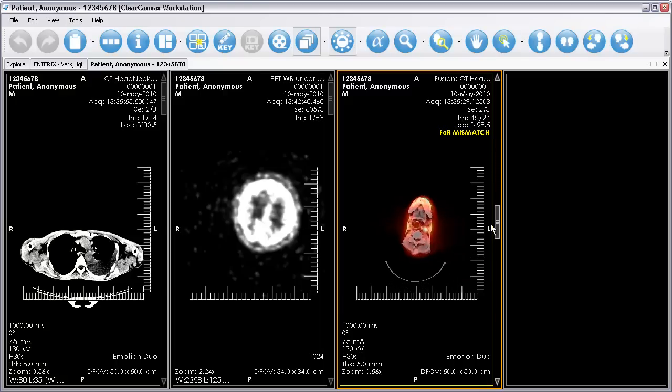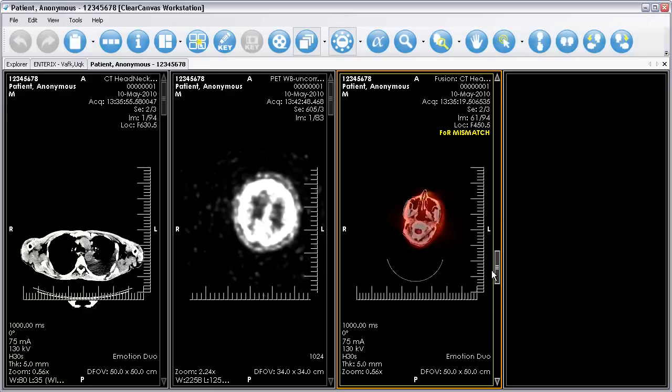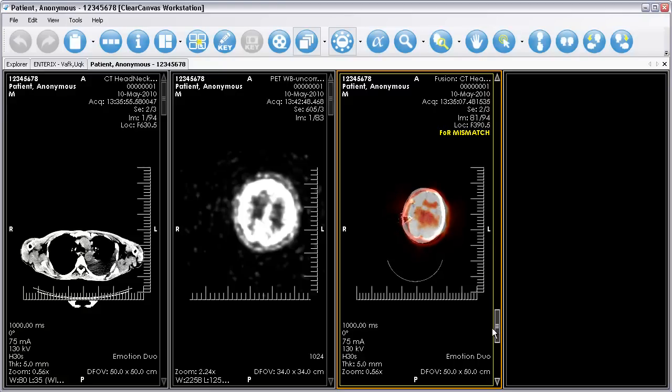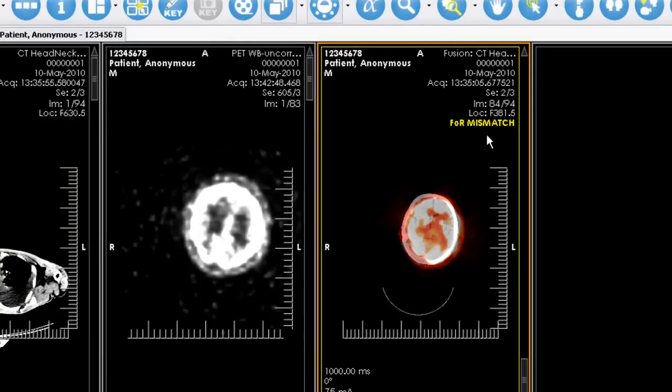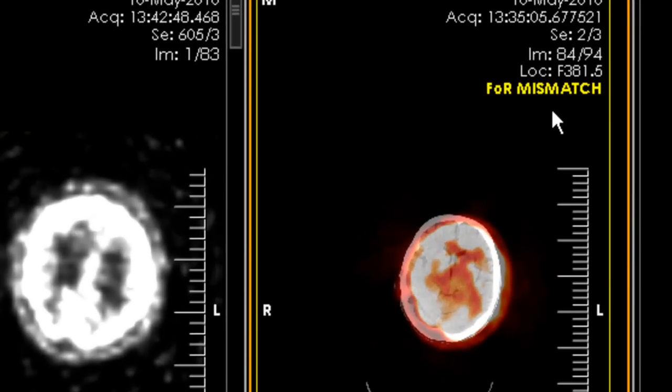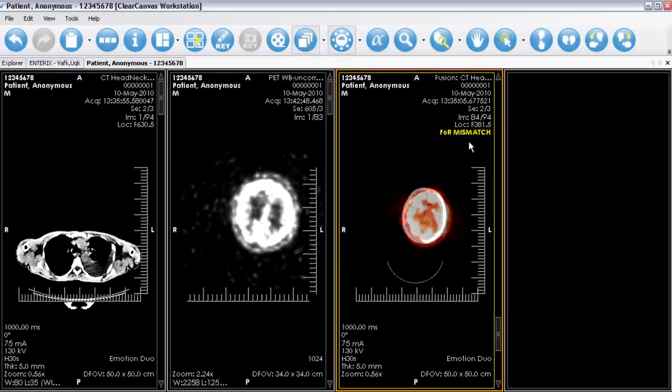If the PET and CT series were not calibrated at scan time to properly produce images using the same patient coordinate space, Image Fusion will still be performed, but a yellow warning label will be displayed to indicate that the image's frames of reference do not strictly match.